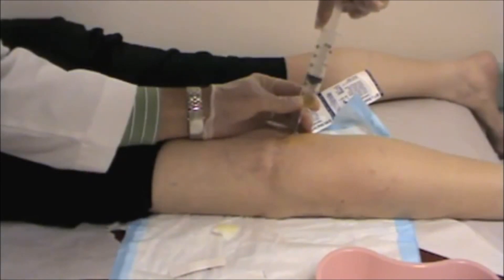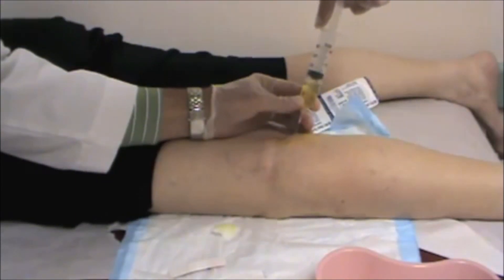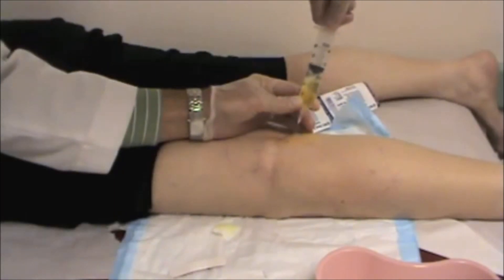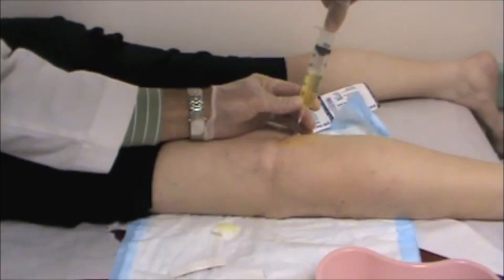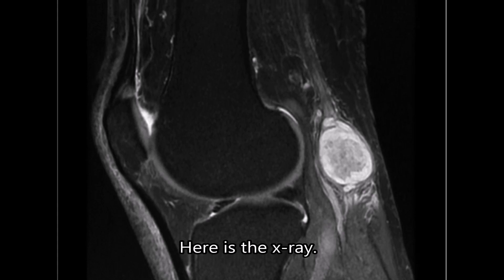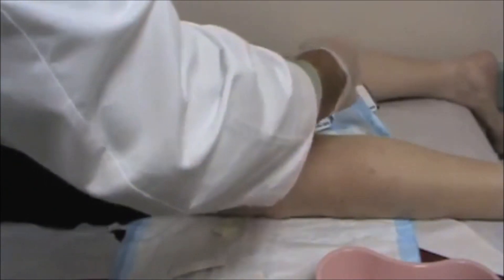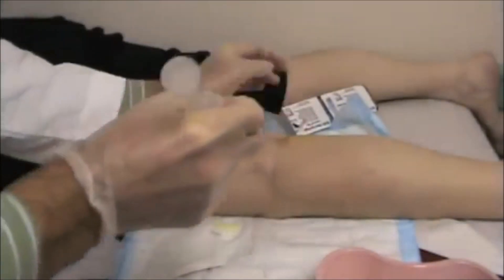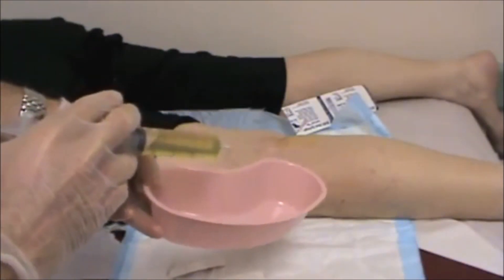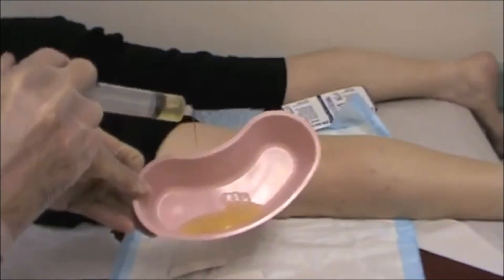It's very thick fluid. Trying not to move the needle — it's quite uncomfortable to move the needle in the back of the knee. And you can see it's very, very thick fluid. It's like a jelly.